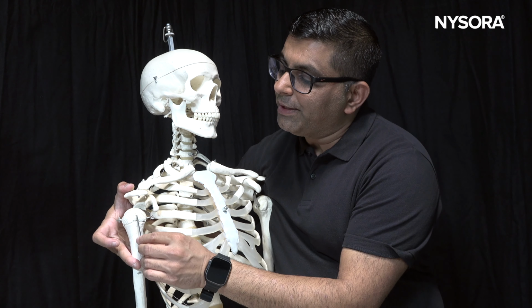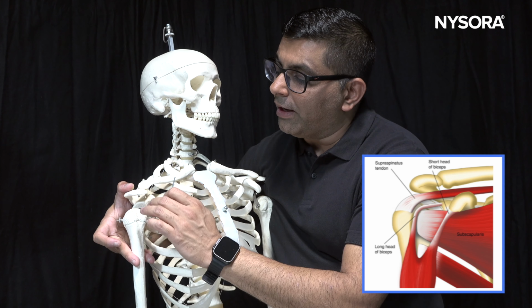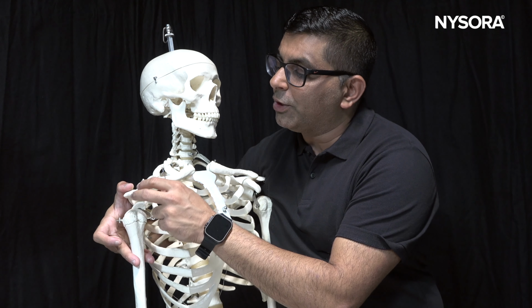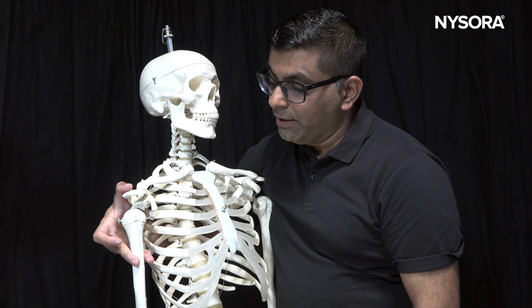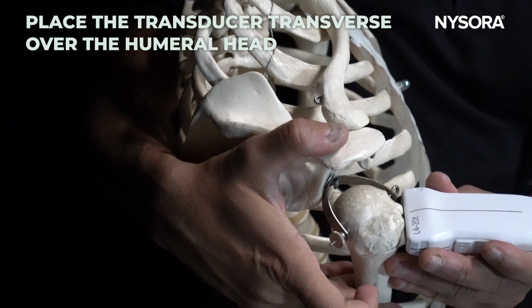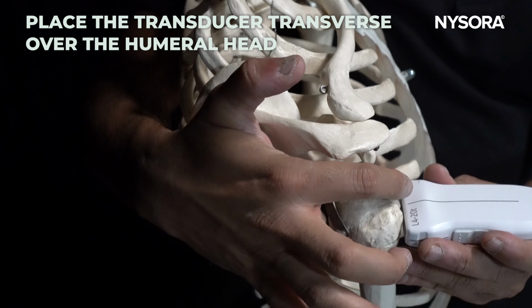The bicep tendon is sitting between the two, and then the bicep tendon goes up and becomes intra-articular, and that's another area to target for the intra-articular injection with an anterior approach in the rotator cuff interval where the bicep tendon has become intra-articular. To perform the bicep tendon injection, the ultrasound probe is placed on the top of the humeral head, where you can see the greater tuberosity, lesser tuberosity, and the tendon.